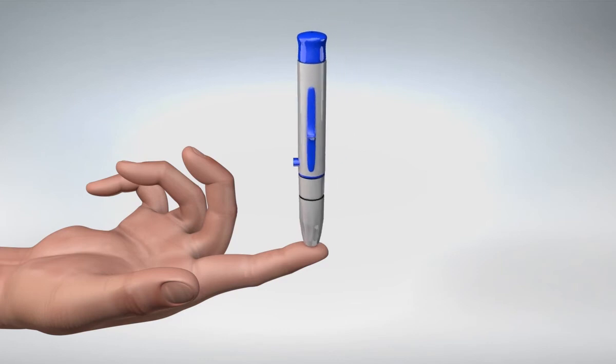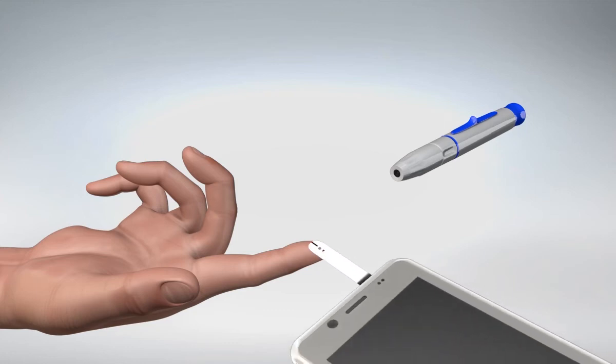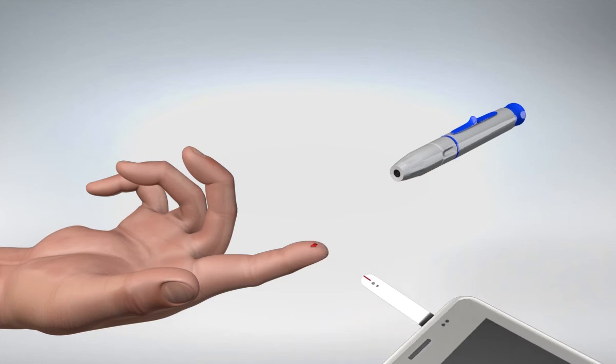Gently touch the lancing device against the side of your fingertip and press the release button. Squeeze your finger gently, if needed, until a blood drop the size of a pinhead forms. Bring the test strip to the blood sample at a slight angle. The test strip acts like a sponge and pulls the sample into the strip through the sample area.